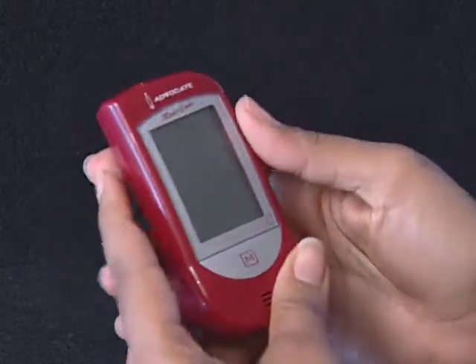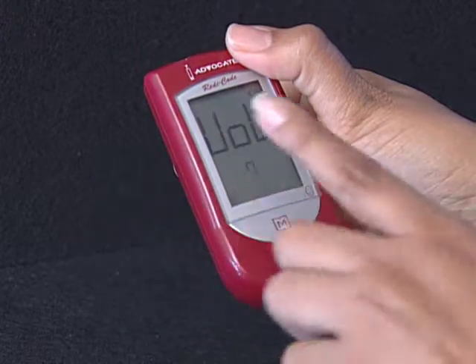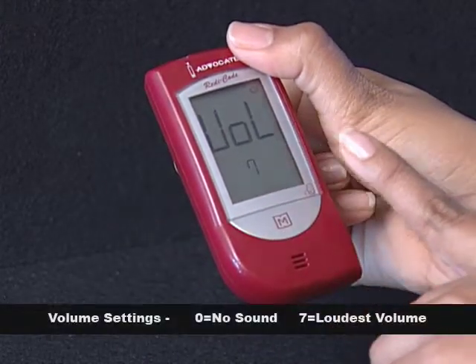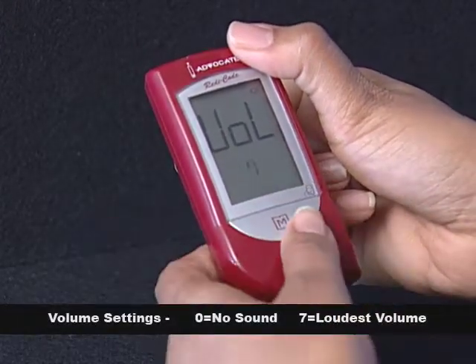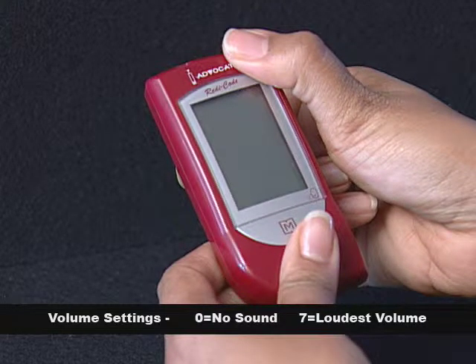Step 9: Select the speaking function. The meter displays VOL, the volume symbol, and a flashing number. Press the M button to select speaking volume from 0 to 7. Then press the Set button to proceed to the next step.